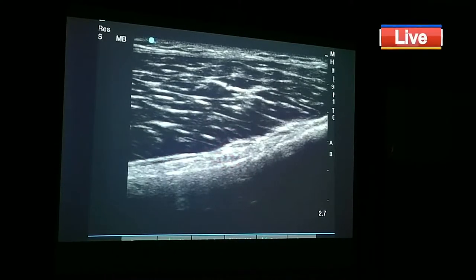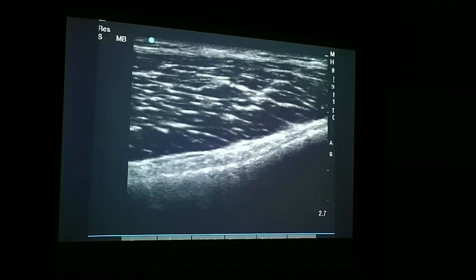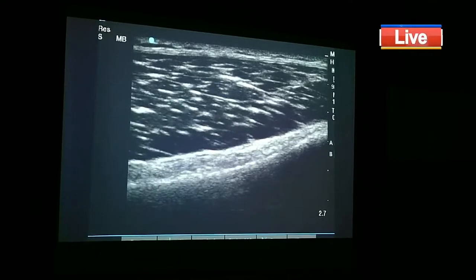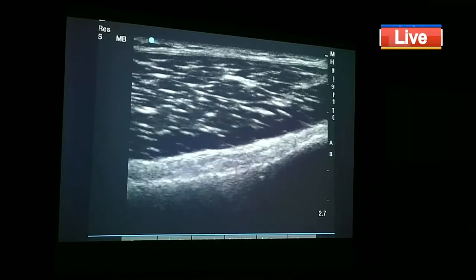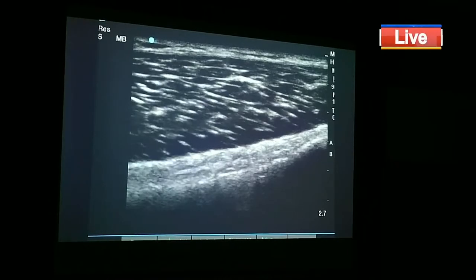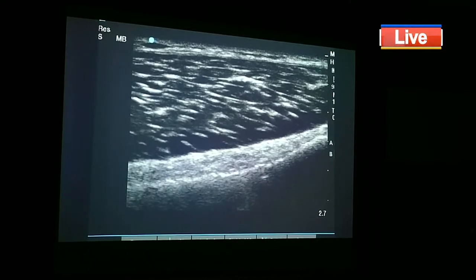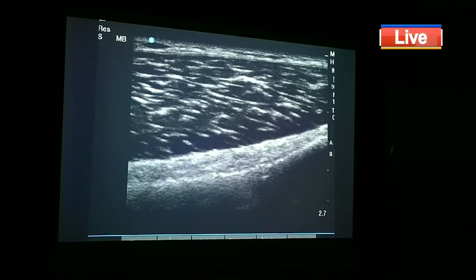Okay, now there is one catch here. Many times, since it's very small and your Doppler may not confirm it, you have to be very aware that it can be a shadow of some other artifact also. What I am scared of is that it will lead to failure, and failure means patient se aapne charge kiya but patient theek nahi hua, iska matlab practice khatam. So now you want to make it more accurate.